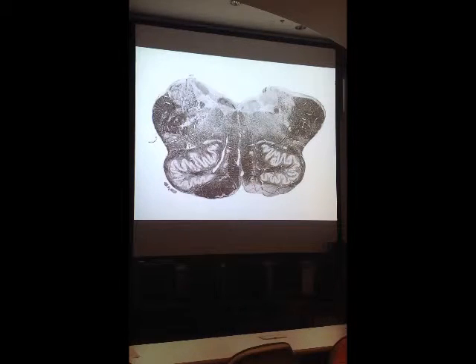We go to the next slide. It's slide 11. Clearly, it's still medulla. Why? Because what do we have right here? Pyramid. What's this nucleus? Inferior olivary nucleus. If it's medulla, what ascending somatosensory pathway dominates this area through here? Medial lemniscus. What major ascending somatosensory pathway is positioned out in here? Spinothalamic tract. A little bit of the inferior cerebellar peduncle on this side.